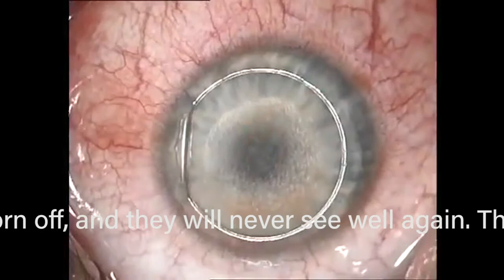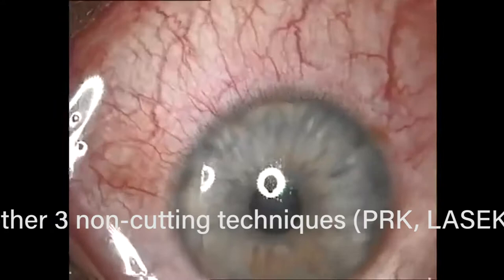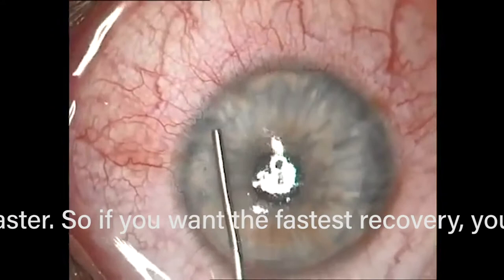If you have enough epithelial cells underneath the flap, you can actually melt the flap, and clearly if you're missing your flap you won't see well. Now it's just irrigating underneath the flap to get rid of any debris — debris under the flap is another issue where you may have to lift the flap again. You could also have inflammation under the flap. Every complication you can have with the metal flap you can basically have with the laser flap, although the incidence of complications is less.